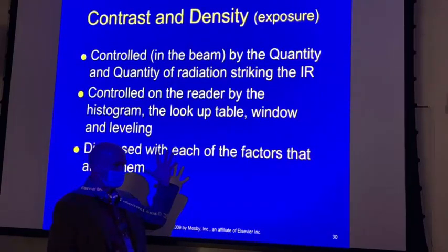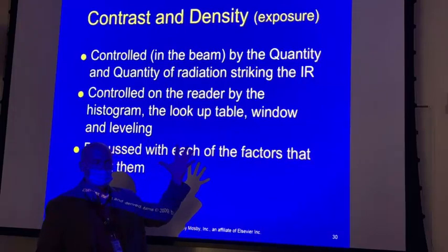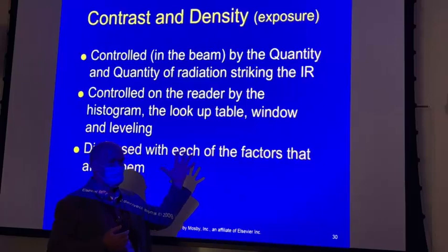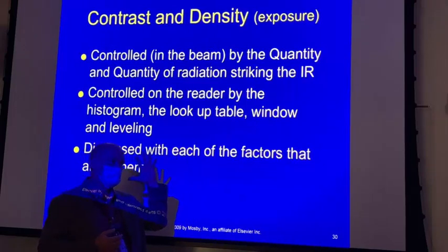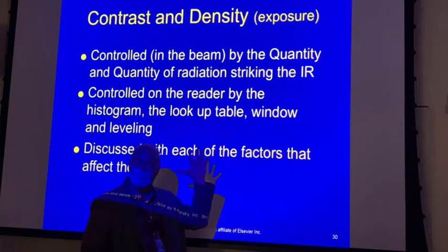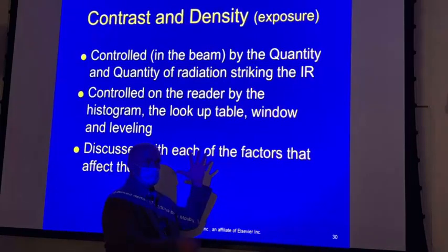Kind of taking that out to just looking like 5 different levels of density. If your histogram that's saved into the computer, you say, okay, I want this range of densities. I want every hand I make to look like these range of densities.